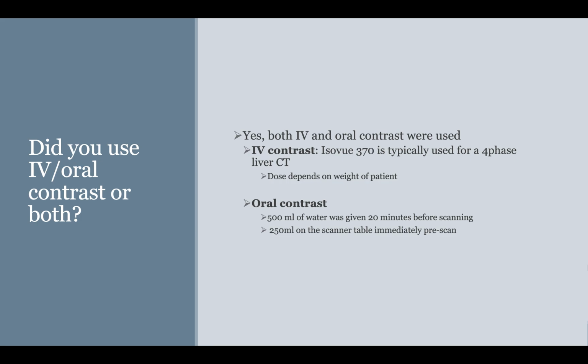And then, looking at a protocol that I found online, oral contrast is also given, and this specific protocol gives water. So 500 mLs of water given 20 minutes before scanning, and then 250 mLs given on the scanner table immediately pre-scan.